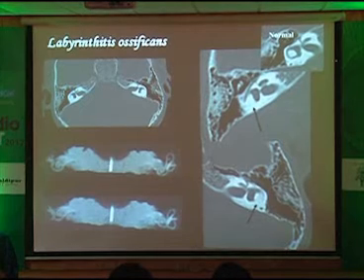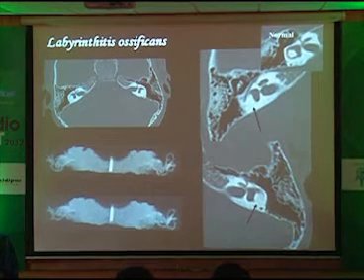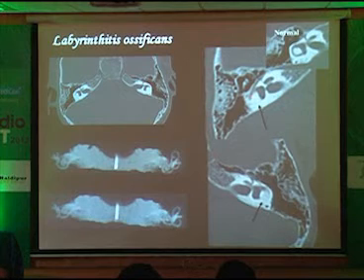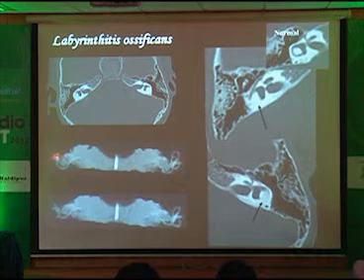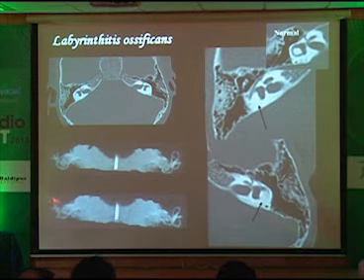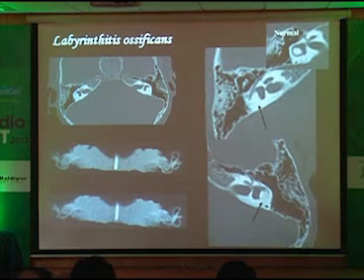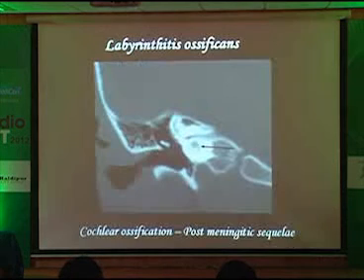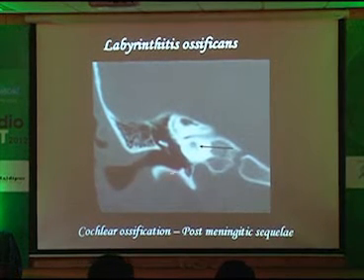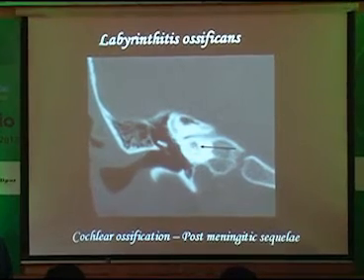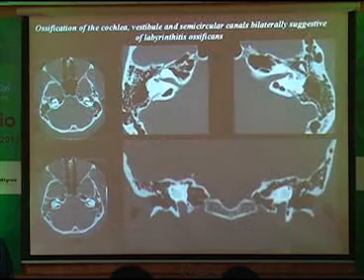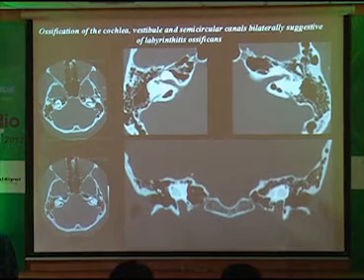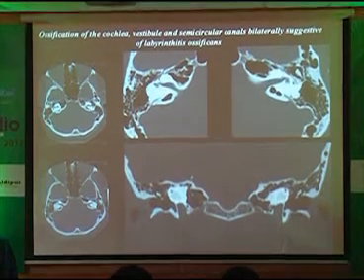The lateral semicircular canal can appear completely ossified, and similarly on the left. On MR 3D imaging it looks amputated, because calcium deposition cannot be seen on MR. In labyrinthitis ossificans the entire cochlea is involved — the commonest cause being post-meningitic sequelae. You see a whitewash — complete ossification; you don't see the vestibule, you don't see the cochlea — almost completely ossified, very classical labyrinthitis ossificans.